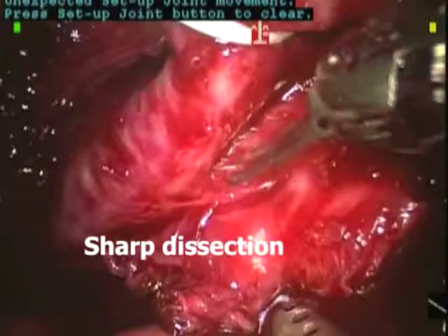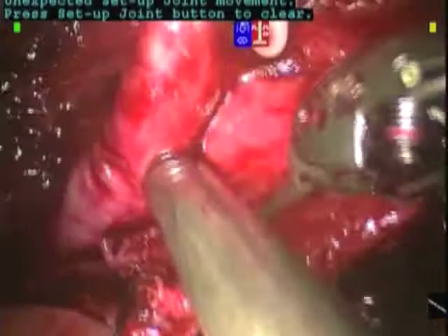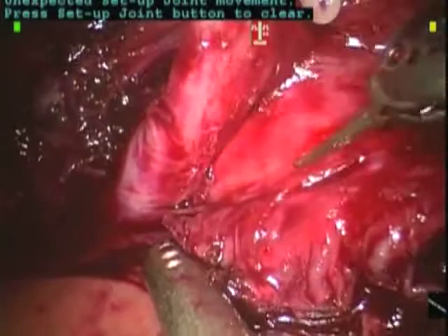Lastly, we free out the posterior aspect. This allows us to deal with the most vital structures underneath the ureter, preventing them from injury while we have the best exposure.